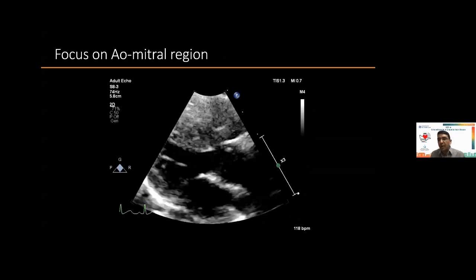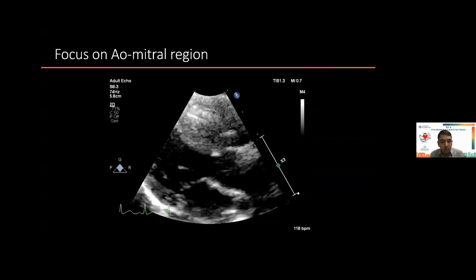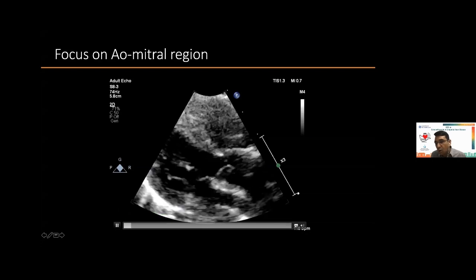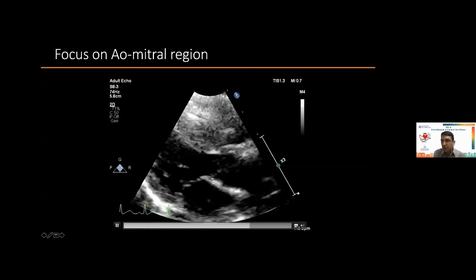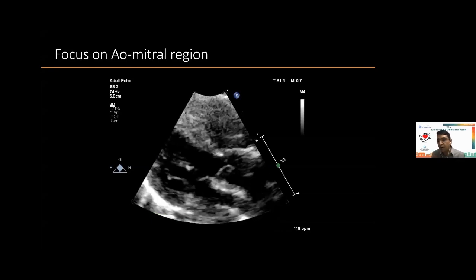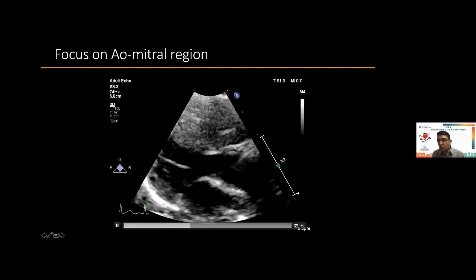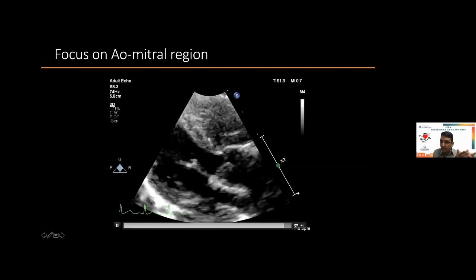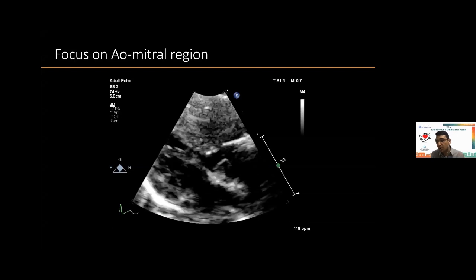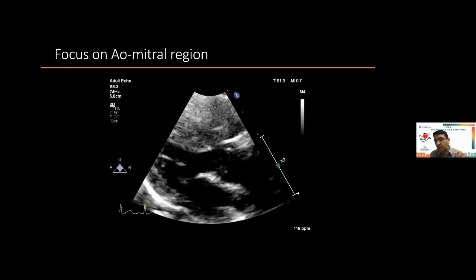Now, focus on the aortomitral region is important. Aortomitral discontinuity, unlike what so many people believe, may not be indicative of DORV. I think that that is not the case. Even in presence of aortomitral discontinuity, you cannot label a case as DORV, because what we are trying to say is that this patch has to close this VSD. So if it is going to be closed like a tetralogy, then we call it tetralogy. And having aortomitral discontinuity is not the sole reason why you should label a case as DORV.